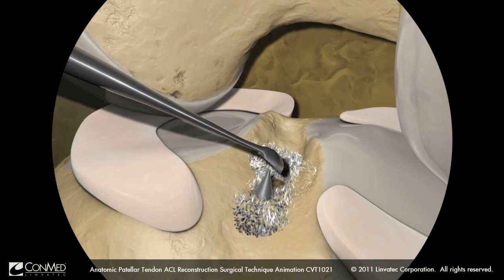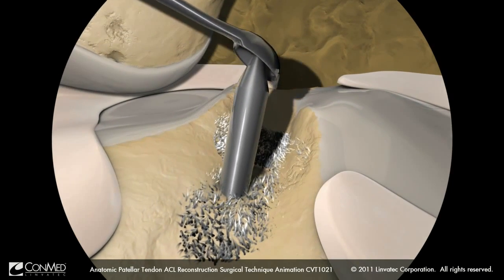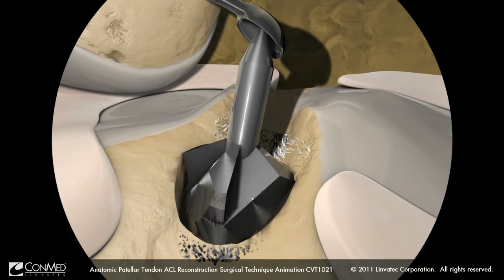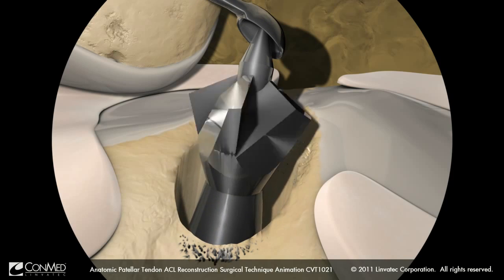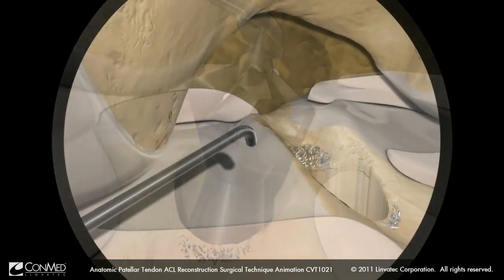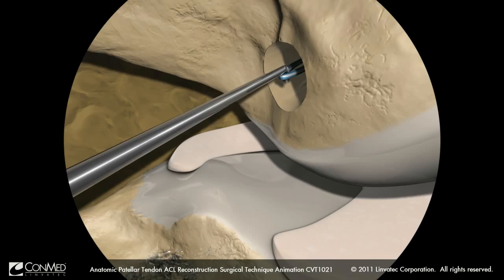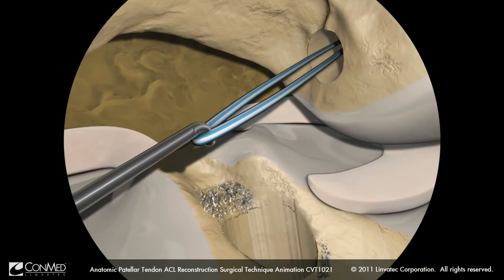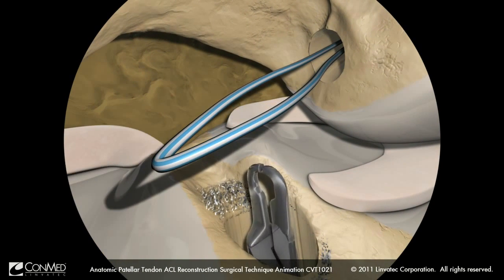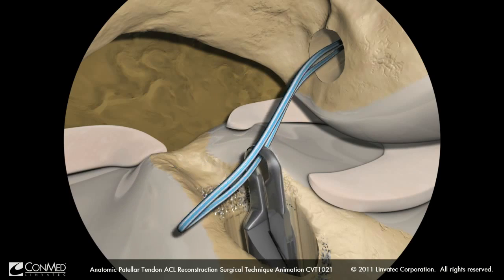A curette can be placed over the point of the guide pin to protect against inadvertent advancement when drilling. Be sure to use the appropriate size badger or sentinel drill bit to drill the tibial tunnel. Next, place a probe into the accessory anteromedial portal to bring the loop of the suture into the joint, then retrieve the loop through the tibial tunnel using suture retrieval forceps.